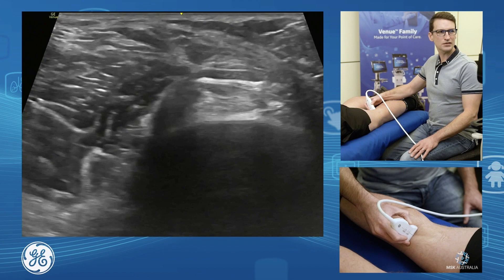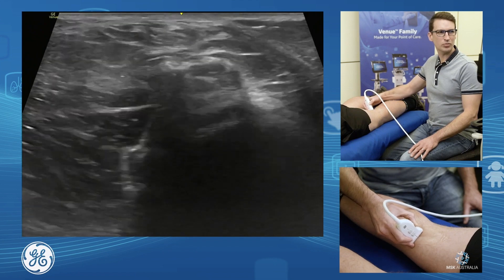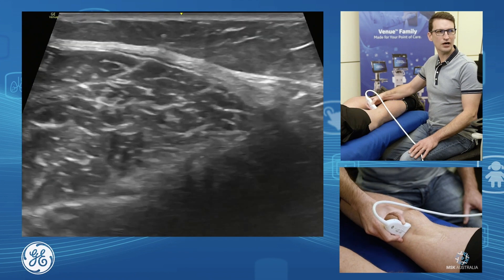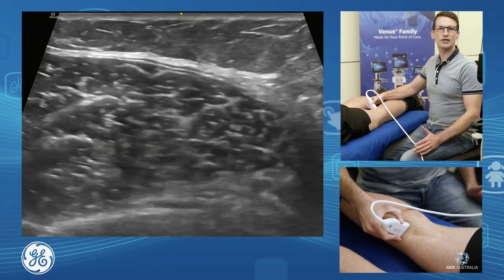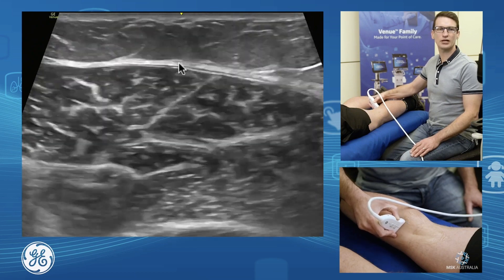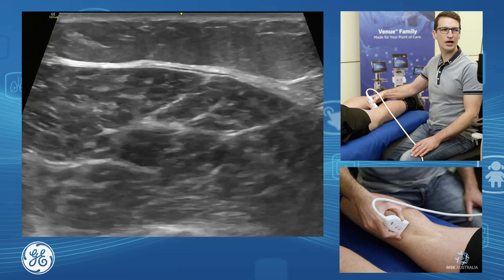Our Baker's cysts may extend up approximately and deep, or extend down towards the calf. And occasionally when we have a leak of a Baker's cyst, we'll see a little bit of fluid and oedema tracking over our medial gastrocnemius muscle into the calf.